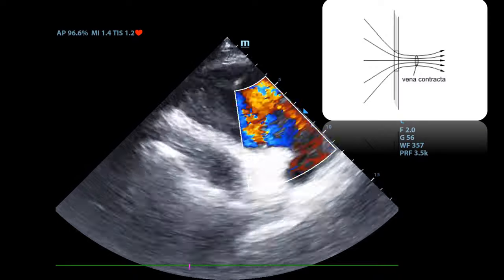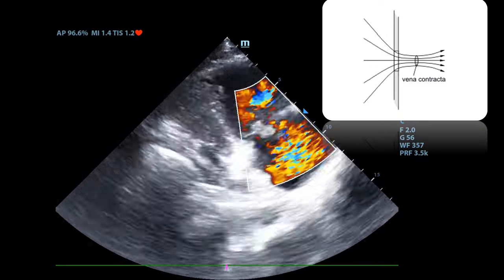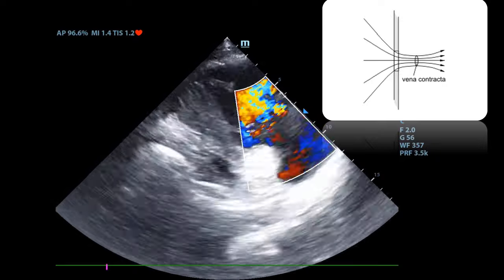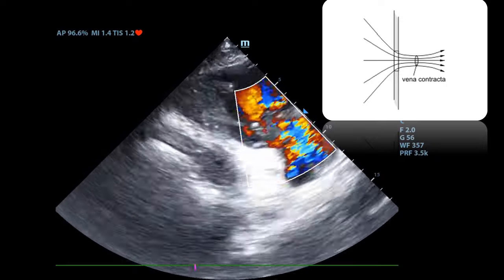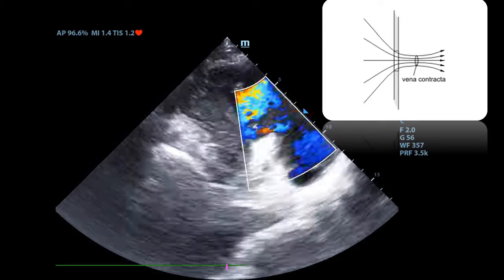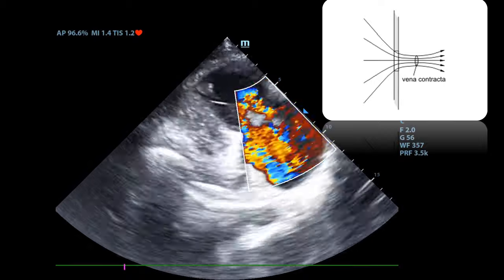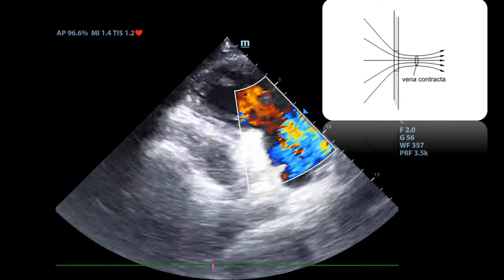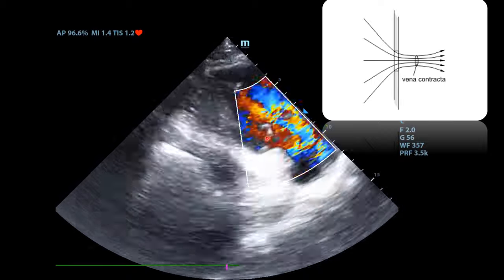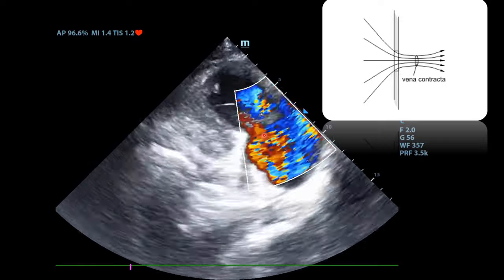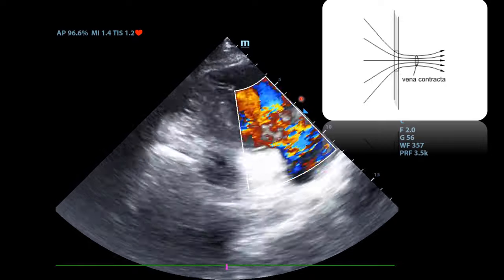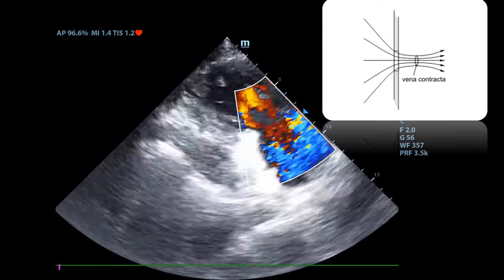This brings up another important concept called the vena contracta. The vena contracta is the point where the regurgitant jet is the narrowest and the fluid velocity is at its maximum. The wider the vena contracta, the worse the regurgitation. You'll notice it is nearly impossible to measure the vena contracta here because the tricuspid regurgitation is severe.